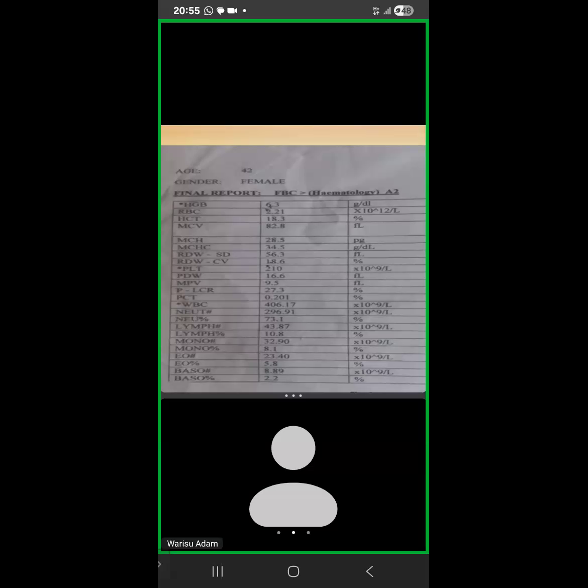Please let me step in once here. When you are commenting on results, it has to be orderly. If you pick white cells, you talk about the white cells situation. Then you pick red cells and talk about the red cell situation. You pick platelets and talk about the platelet situation. That is commenting on results. So like here, you talk about the red cell picture as you see on the full blood count, then the white cells, and then the platelets. And then finally, your presumptive or provisional diagnosis would come.